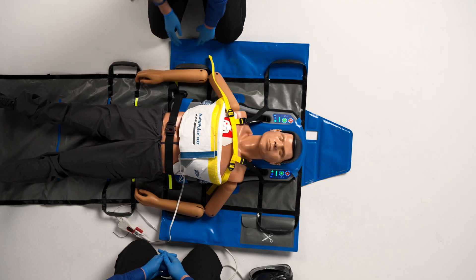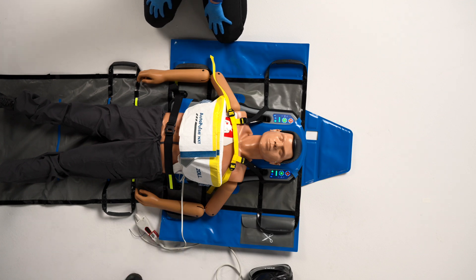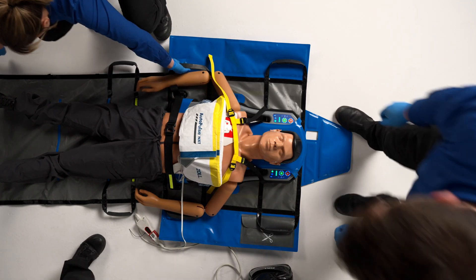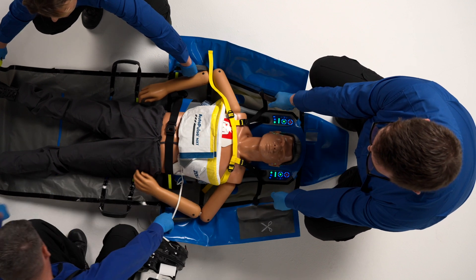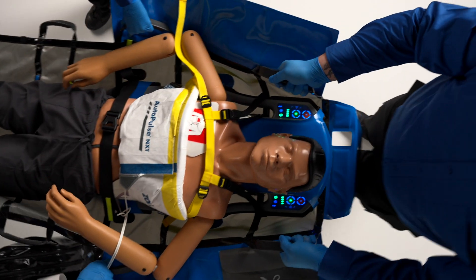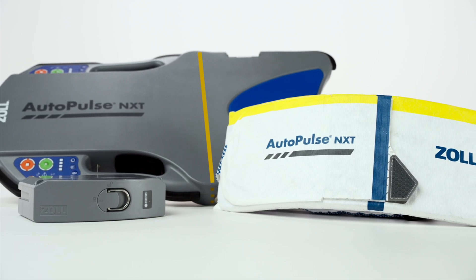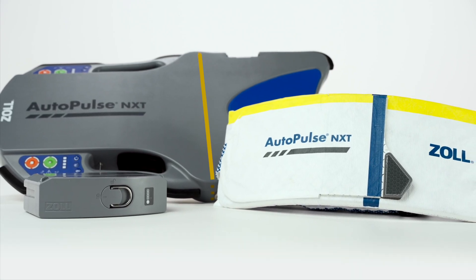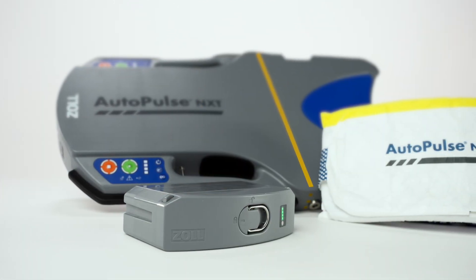With the Quick Case Carry Sheet supporting the patient, use the handles on the side of the Quick Case Carry Sheet to move the patient and platform together. The AutoPulse NXT Resuscitation System can continue compressions as providers transport the patient from the scene to the hospital. We have now reviewed EMS deployment of the AutoPulse NXT Resuscitation System with the Quick Case Carry Sheet and shoulder harness for resuscitation on the move.